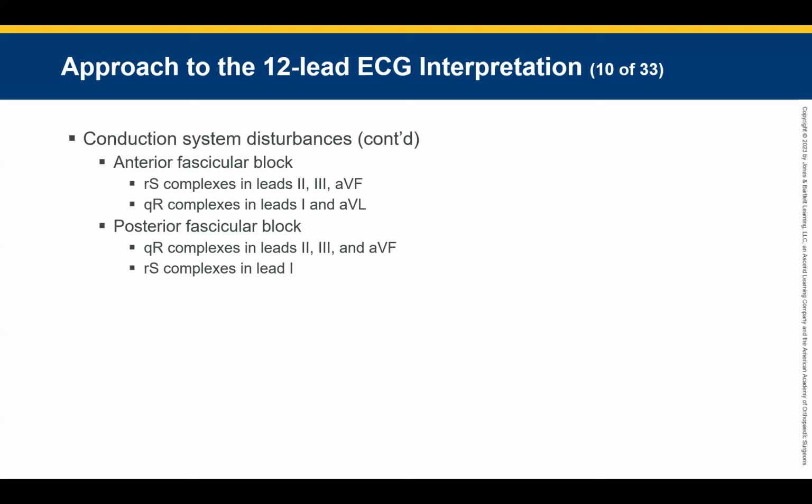I think I'm spoiled, because the EKG you're talking about, that's beautiful, that's all you have to look at. So then you pull up an EMS one. Yeah, it's not the same. You're gonna have some adjustments. Is there a way to turn that on the monitors? No, it's monitor specific. So what do you guys have? 15s. Going to the 35s. I don't know if 35s have it or not.